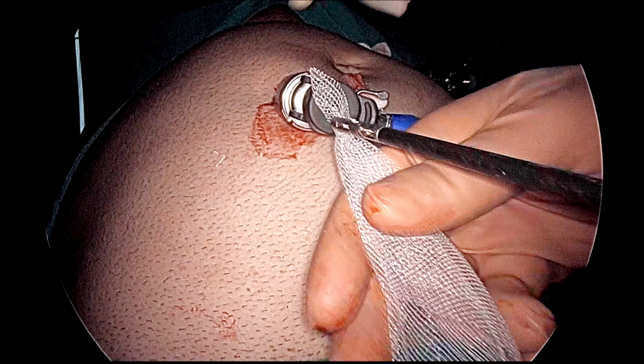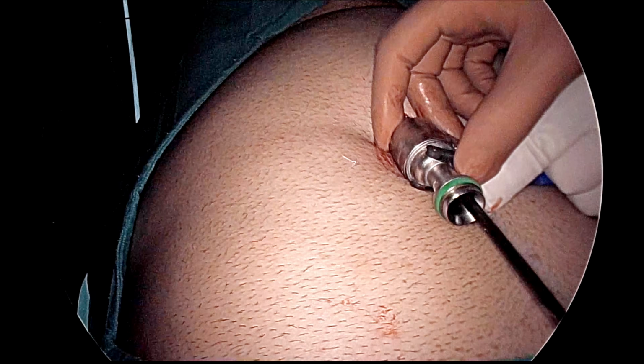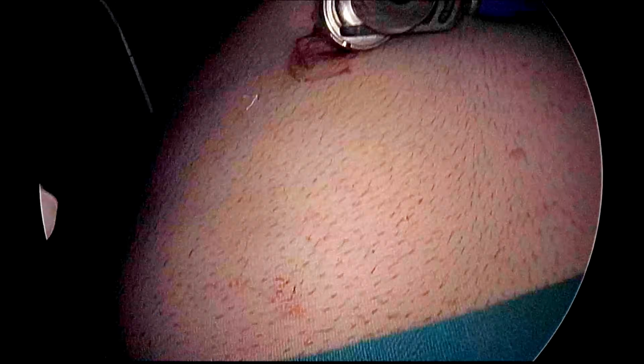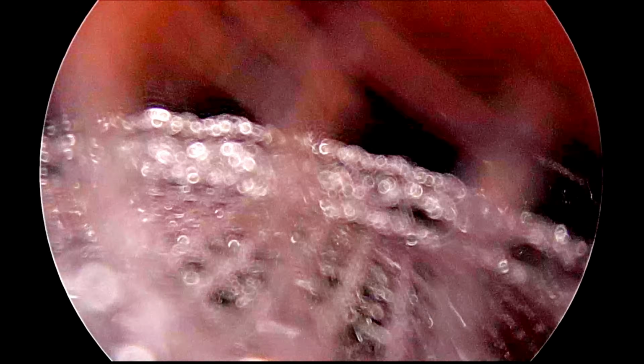So, now this is the mesh and we are using a 15 by 15 mesh, and that mesh is directly introduced. You can open the valve of the cannula and directly through the cannula you can introduce it. And once it is inside, as we can see, now you will spread it. During spreading, we have to take care that the mesh must be spread all around the defect, so that the center of the mesh should be in the center of the defect, and one of the corners should be on the inferomedial corner, on the Cooper ligament.